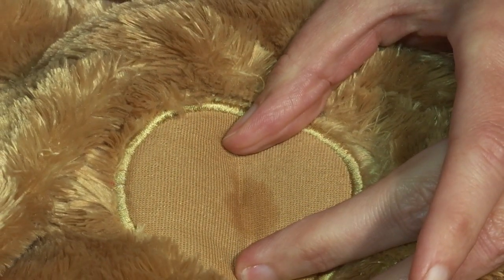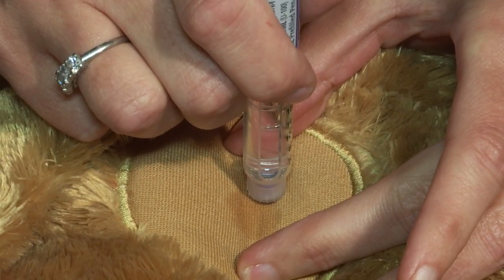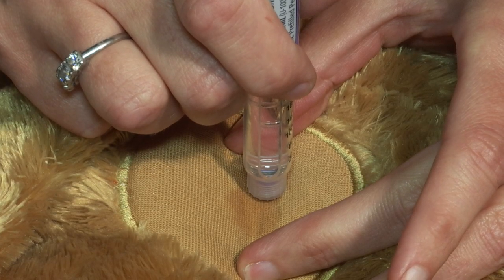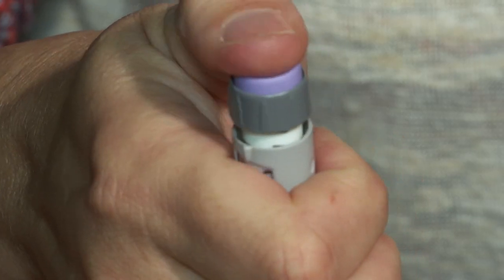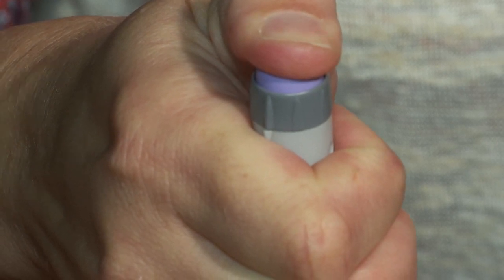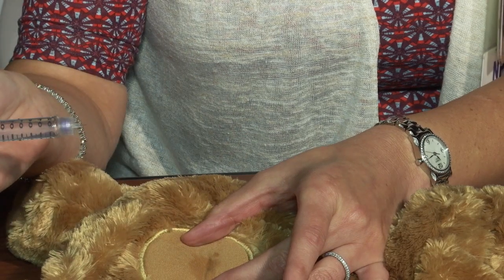Insert the pen needle into the skin on the arm, thigh, abdomen, or buttocks and hold until the entire dose has been delivered. The needle and pen device are designed to deliver the dose slowly over several seconds, so count to 10 once the injection button has been pressed down completely.